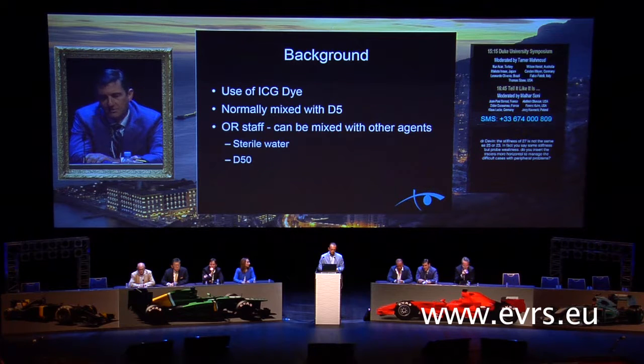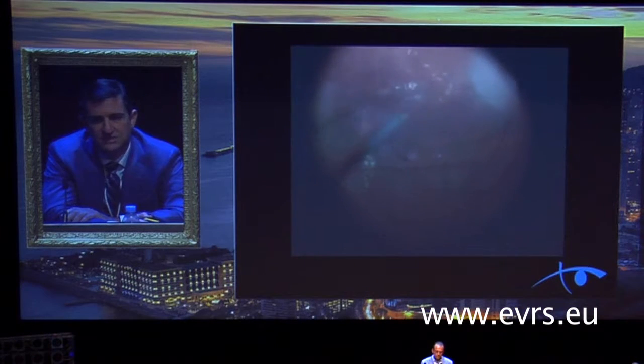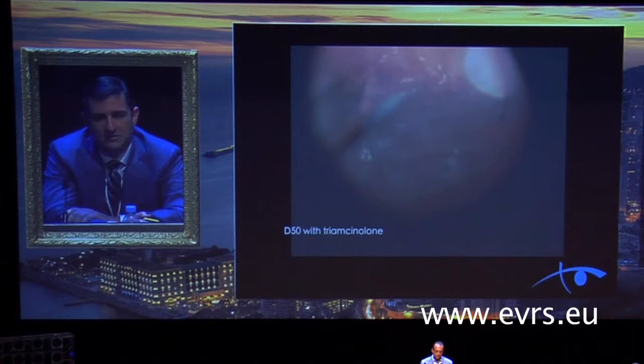So after that happened, the case I'm going to show next is injection of D50 in the eye. So you can see how heavy it is. It just kind of falls to the back of the eye. There's a little bit of triamcinolone in it, but really not that much. It's mainly just clear fluid, and you can see a little bit already on the top of the retina there.